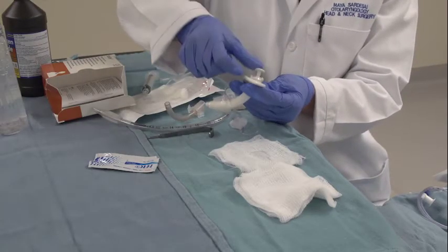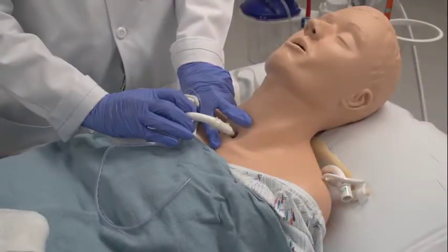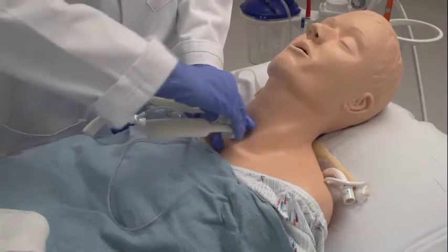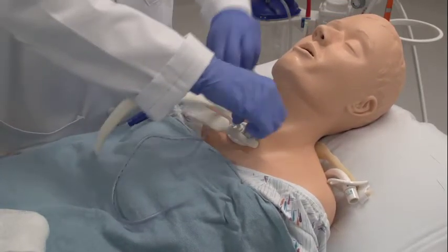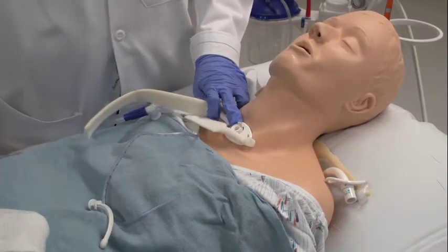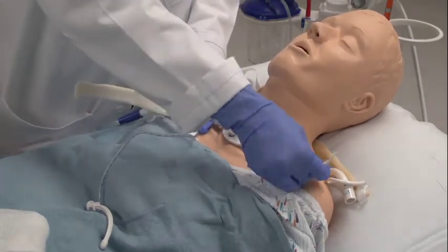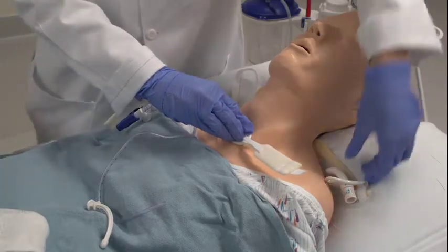Insert the obturator into the trach tube and apply lubrication. Applying firm pressure and keeping your thumb on the obturator to keep it in place throughout the insertion process, slide the tracheotomy tube into the trachea. Stay sutures may be in place on the trachea. If they are, hold them apart to provide counter-traction to the reinsertion of the tracheotomy tube. Once the tracheotomy tube is in place, remove the obturator right away so the patient can breathe through the trach, and reinsert the inner cannula if the trach tube has one.